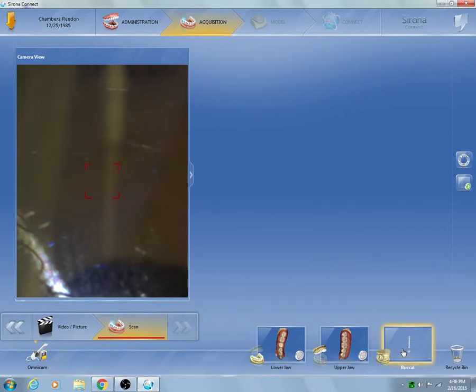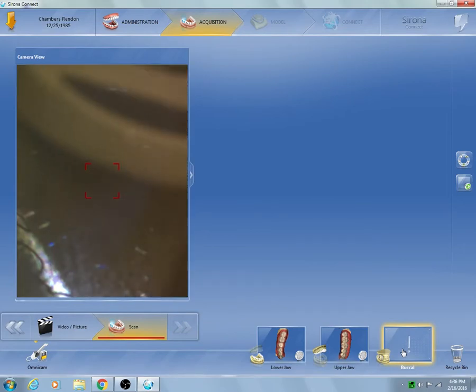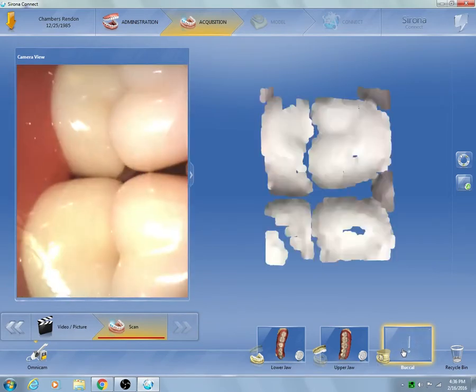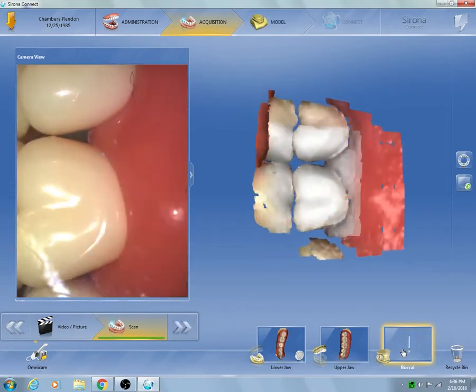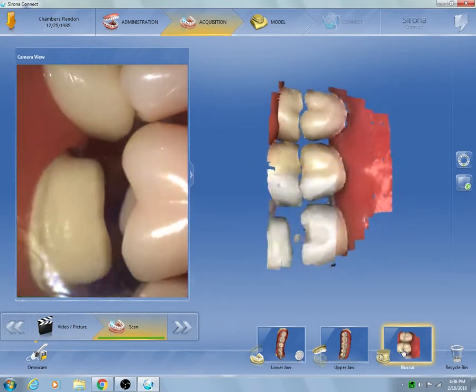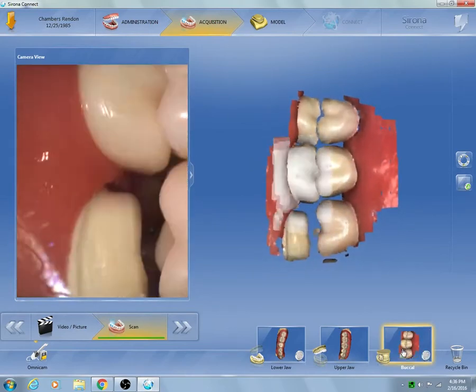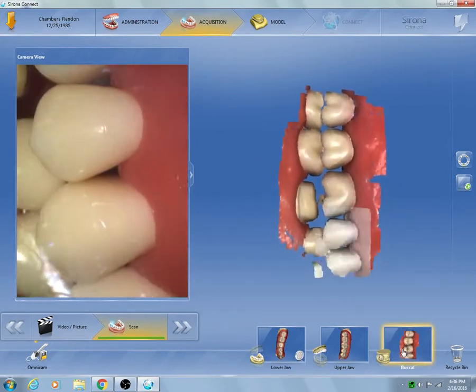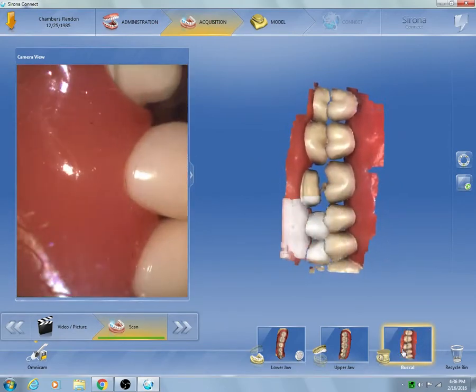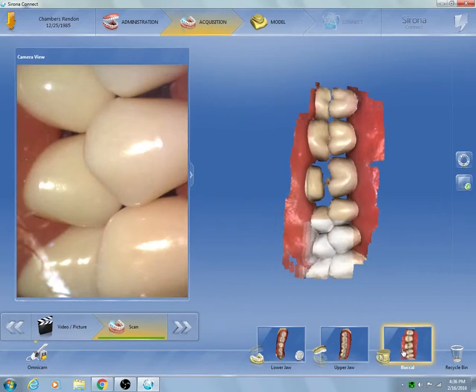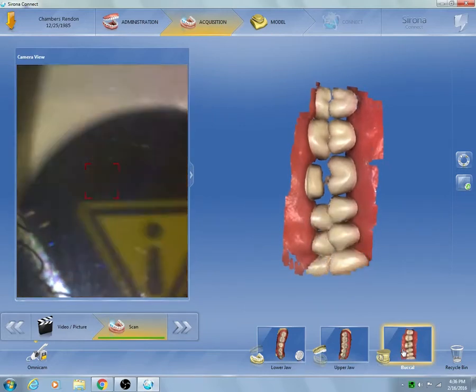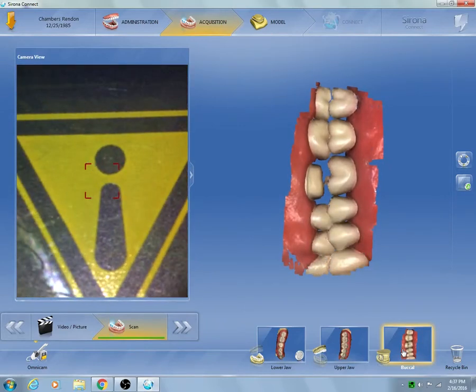Now we'll go to buccal. At buccal we're going to scan enough information on both sides of the mandibular and maxillary right-hand side, including the gingival surface, to have a good buccal bite that will stitch effectively for us.